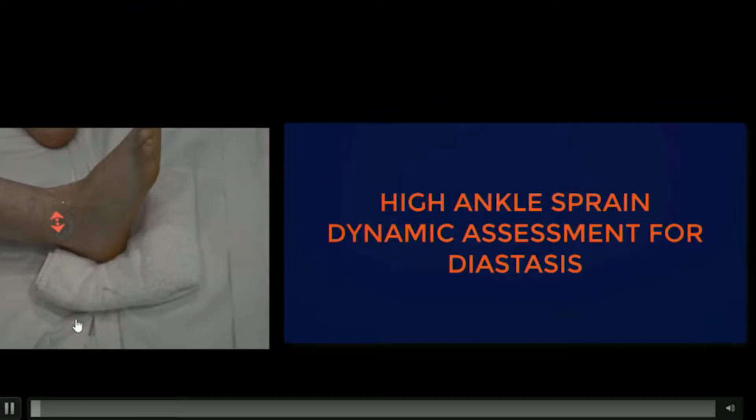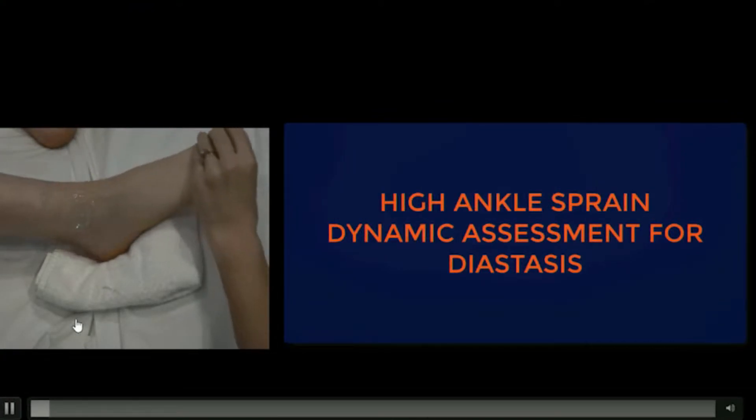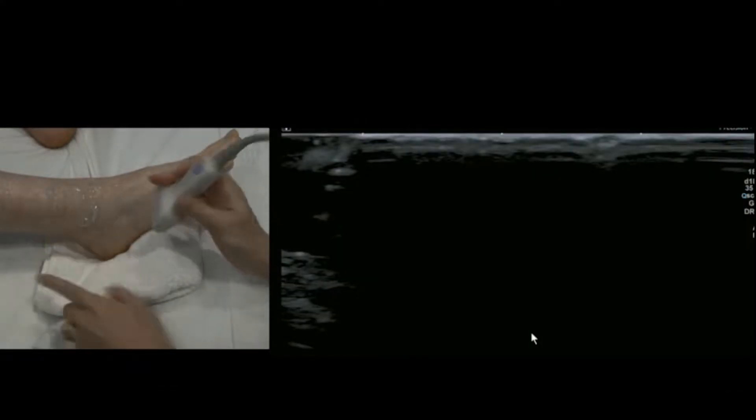I wanted to talk about high ankle sprain dynamic testing today. High ankle sprain involves the syndesmotic complex — the AITFL, the tibiofibular ligament. Here's how to perform a dynamic test. This is of interest to surgeons: they want to know, do I need to do a tightrope repair to restore stability to the joint?